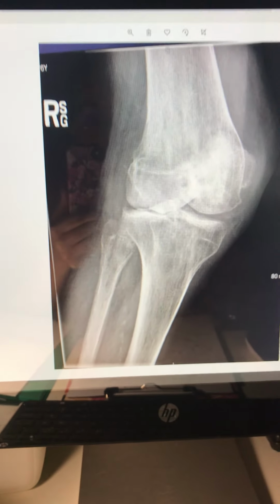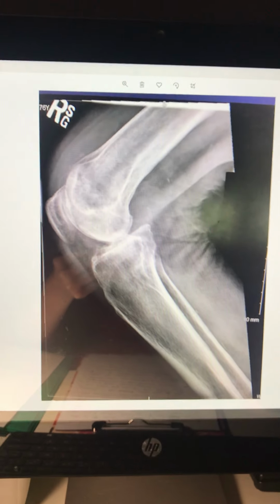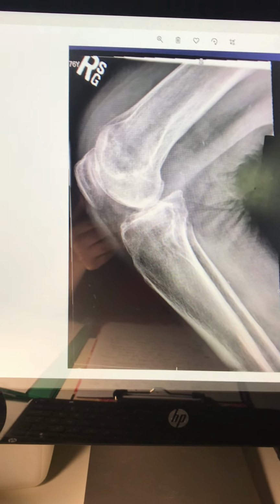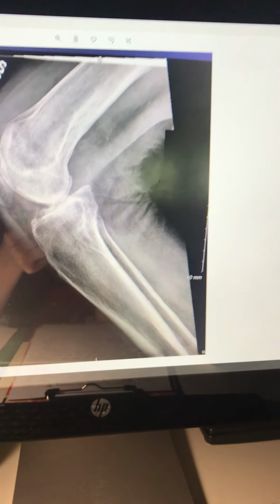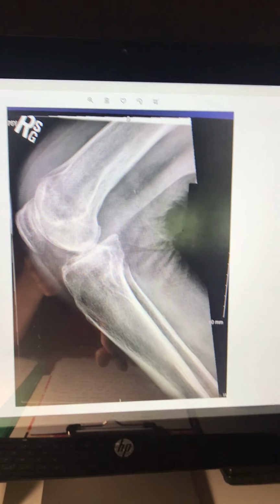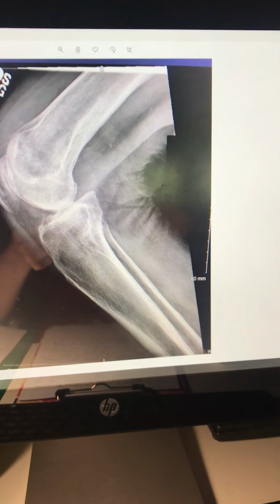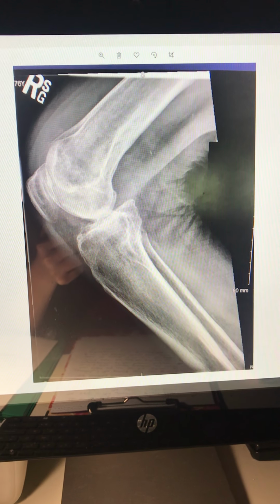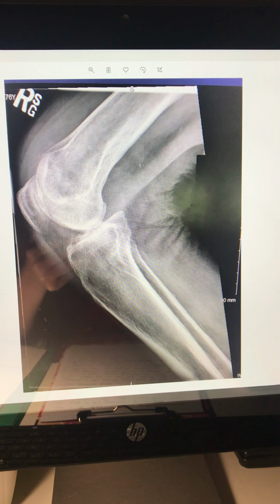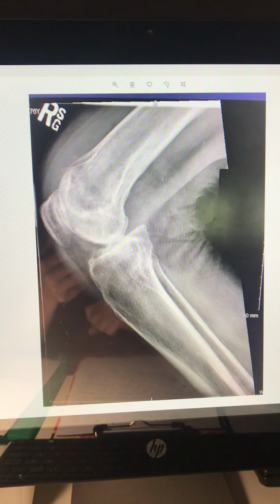Moving on, the lateral. The patient was able to frog-leg her leg out and into the lateral position. The image is a true lateral, as you can tell by the femoral condyles. They're superimposed. I know I should have, she's in a 90-degree flexion. It only calls for about 20 to 30-degree flexion, so I should have had her bring her leg down more, and it would have opened this, what is that called, the patellofemoral joint.